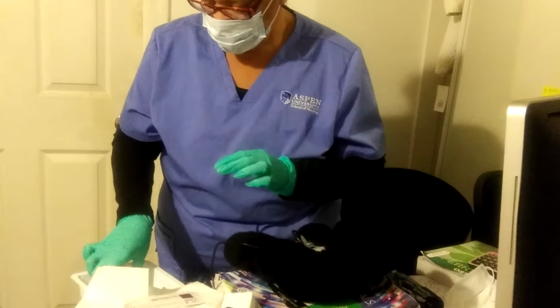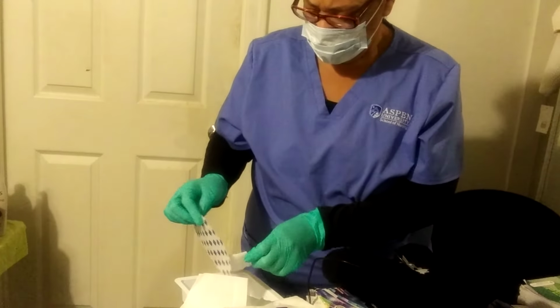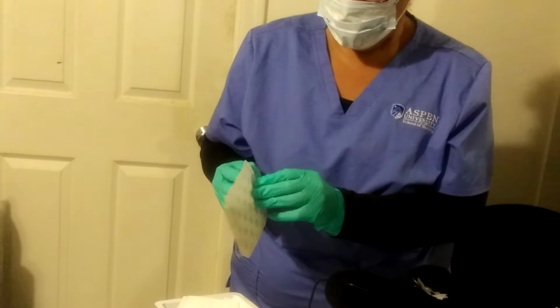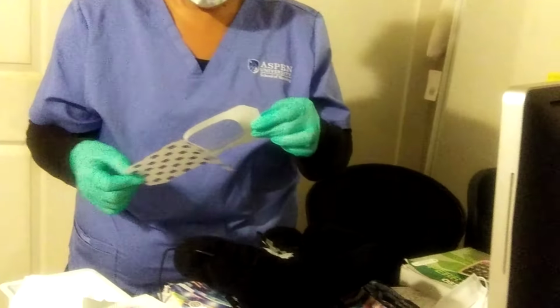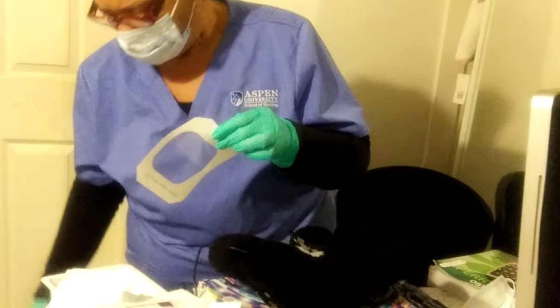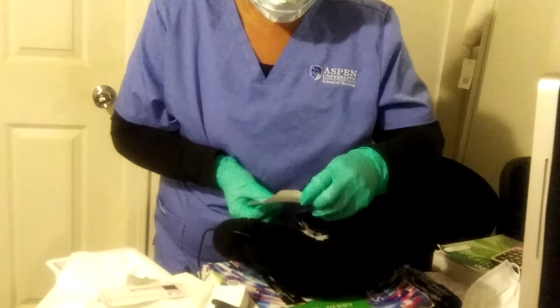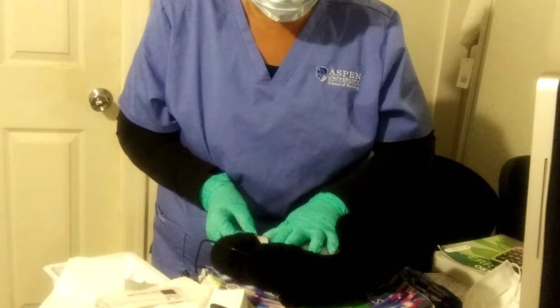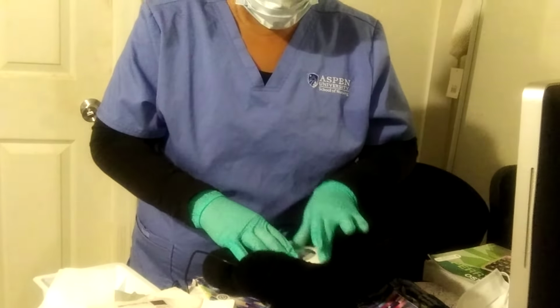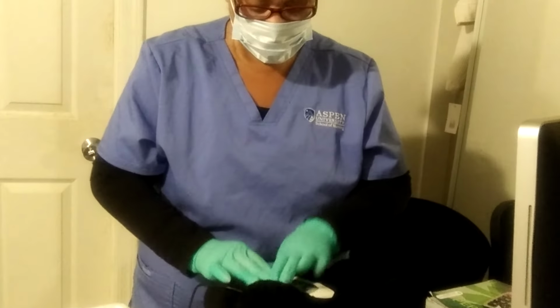Okay. I'll get the Tegaderm. And I'll place that on top of the site. I'm pressing firmly just to make sure it sticks very well.